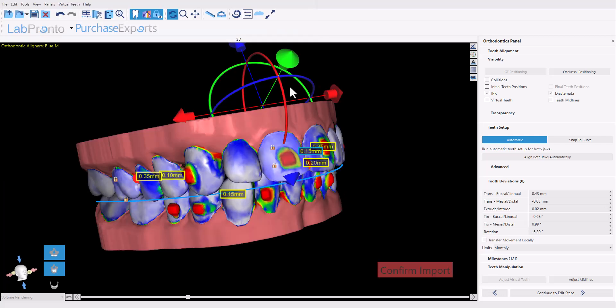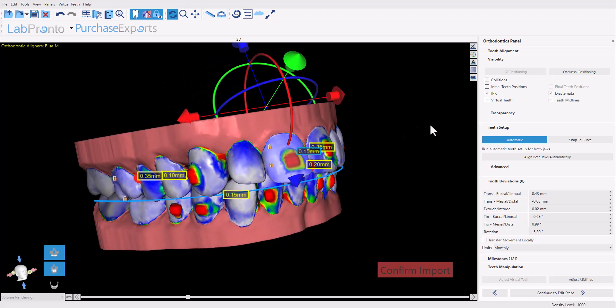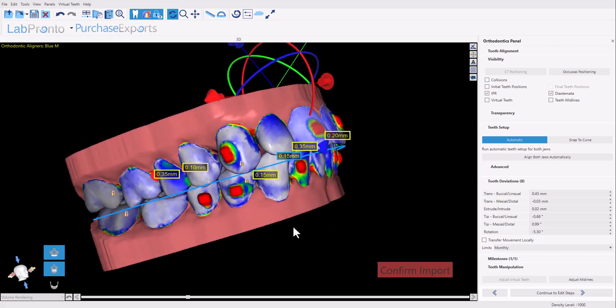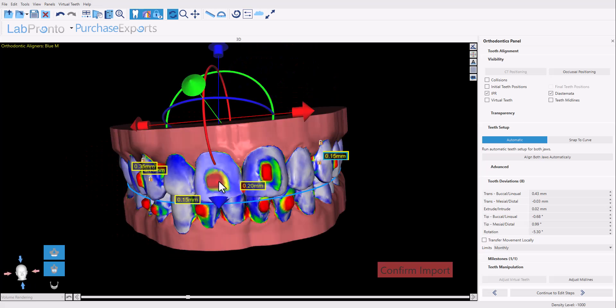The software is now showing us best fit matching between the teeth in the new data set and the teeth in the original data set. The area that has the blue indicates proper correlation between the tooth in the new data set to the tooth in the previous data set. And we can see in the area with the attachment, there's no correlation as the original data set didn't have the attachments attached to them, and the new data set obviously does.